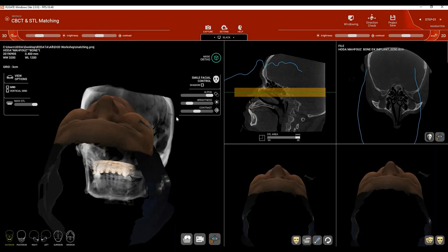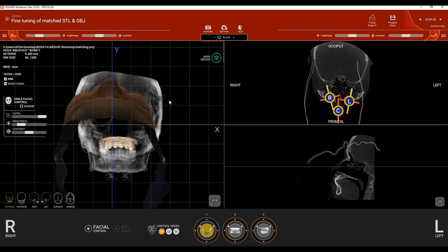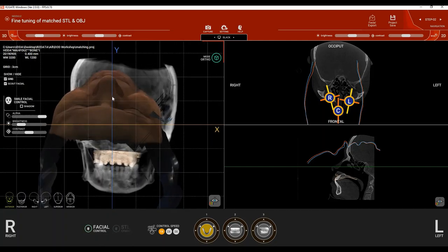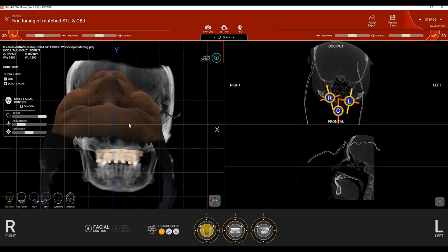This initial matching is the starting point; we'll refine it in step number 2. What we now have on the left side is a composite of three scans: the CBCT scan, the scout scan, and the smile scan. Go ahead and click 'close' or 'hide scout facial scan,' leaving only one facial scan to match to the CBCT.